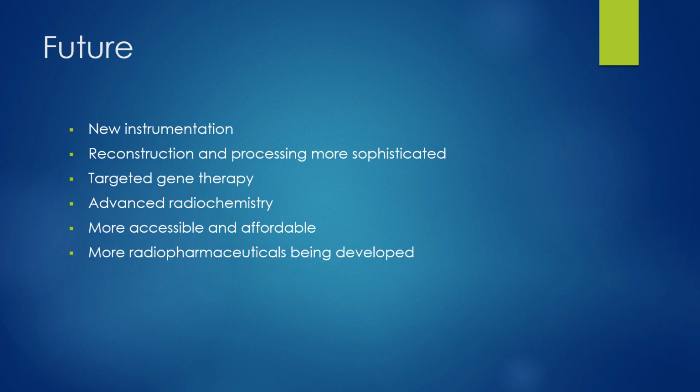And there are a lot of new radiopharmaceuticals being developed. For the longest time, FDG was all we had for PET oncological imaging, and now, as you see from earlier lectures and what we'll talk about later in this class, there are a lot of them now, and they're increasing in number, and it makes it a lot easier and more specific. It gives cancer patients a lot more options, and oncologists a lot more options to get better answers, better data to make better decisions for their patients.